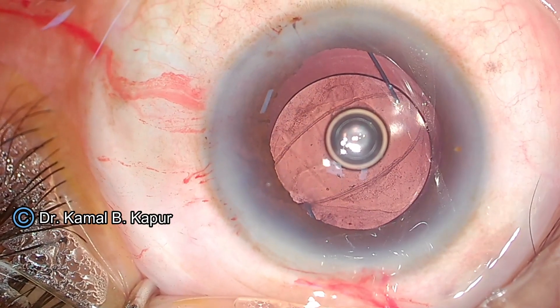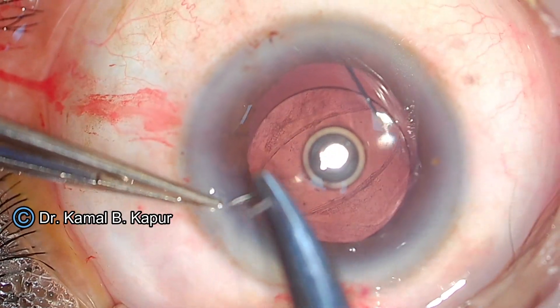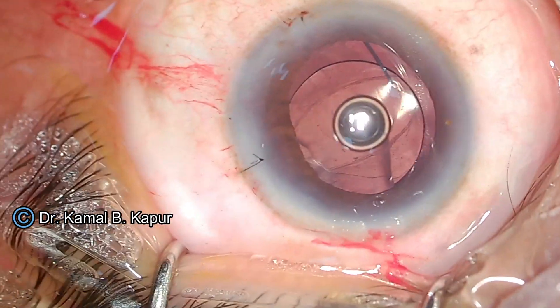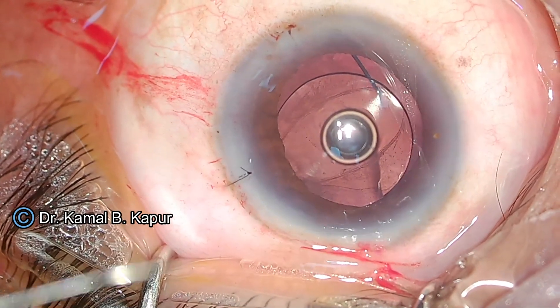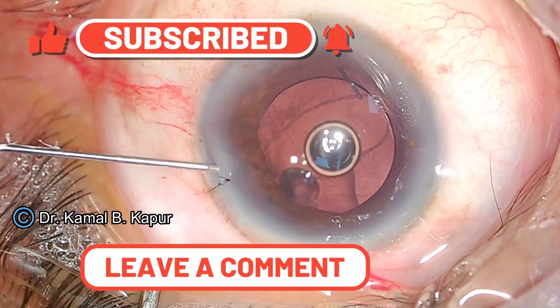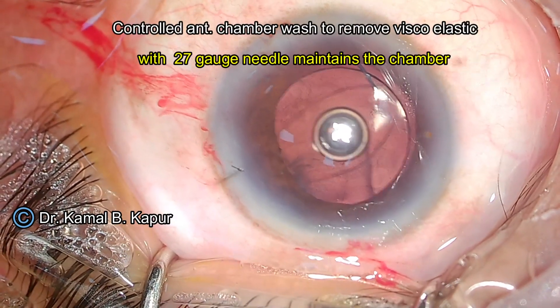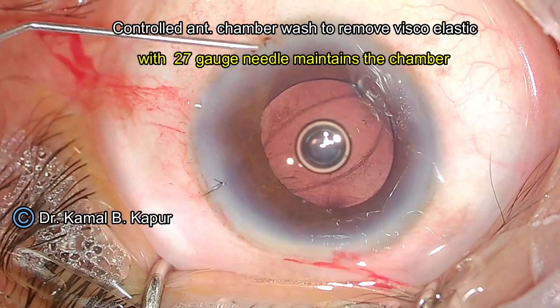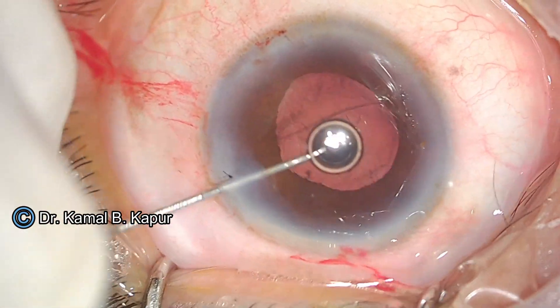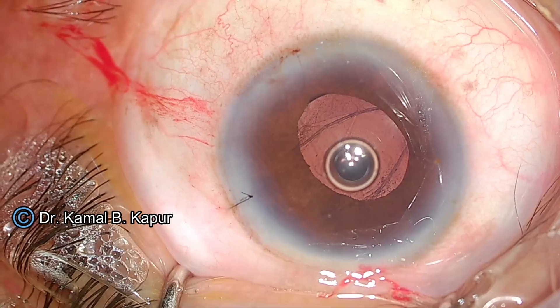I use a different style of viscoelastic removal in such cases — I try to avoid using an irrigation-aspiration cannula as much as possible. I suture this case first because the wound has been enlarged. My recommendation is that in case of a posterior capsular break during surgery, it is always a good idea to suture the wound, even if it appears watertight, because it is always more secure. To wash out the viscoelastic, I dip the scleral wound and give short bursts of BSS into the anterior chamber, which meticulously cleans it up. Some surgeons can do bi-manual irrigation-aspiration with a low bottle height and low flow — but be careful, as higher flow can hydrate the vitreous and cause more problems.